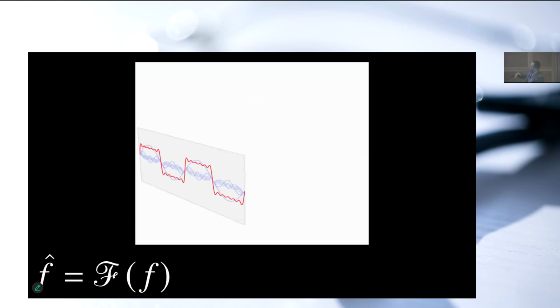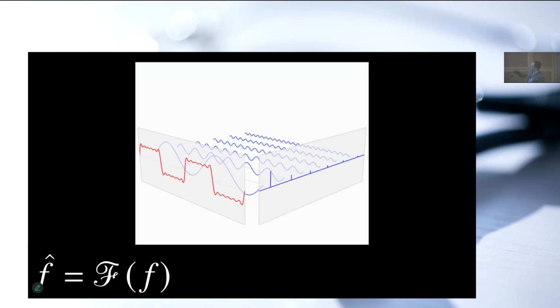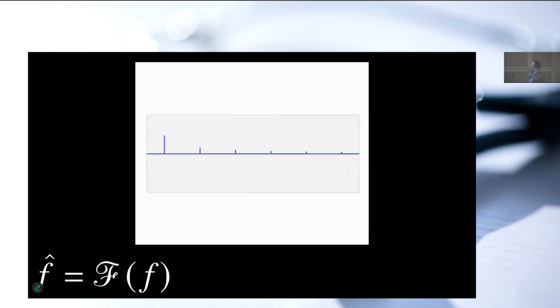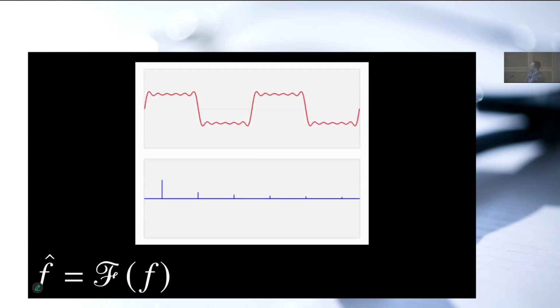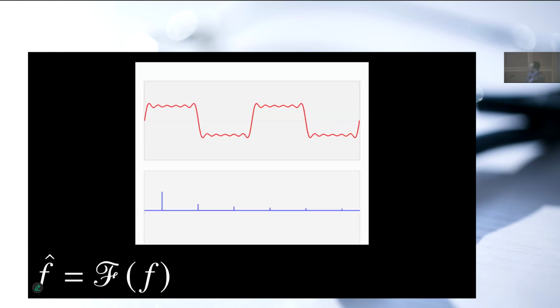And in fact, if you break it down, you can stratify this original signal by those sines and cosines of decreasing amplitude and increasing frequency. So it gives us two views of the exact same function. This is the frequency domain interpretation, and this is the time domain interpretation. And so you can see that with each successive sinusoid that you add some clarity onto this.